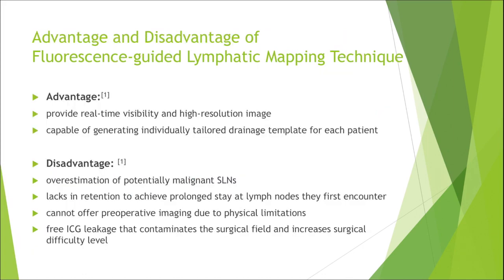For advantages of this technique, fluorescent imaging offers real-time visibility and high-resolution images. So, if combined with a radio-guided technique, this will achieve great preoperative and intraoperative imaging results. It is also capable of generating an individual tailored drainage template for each patient.